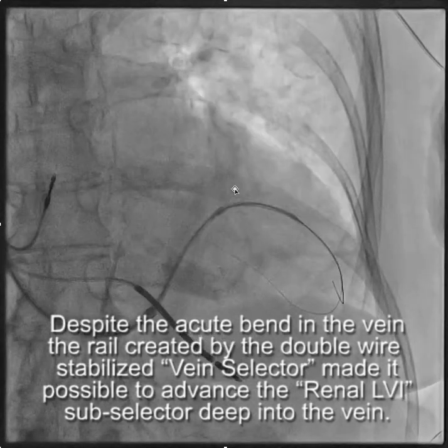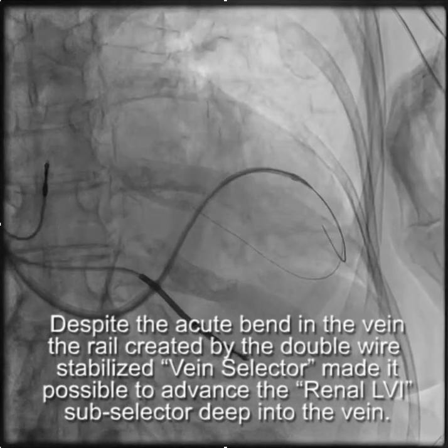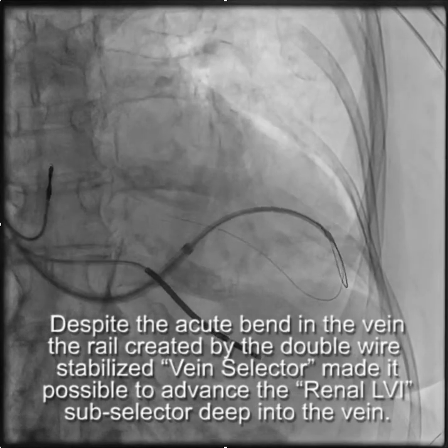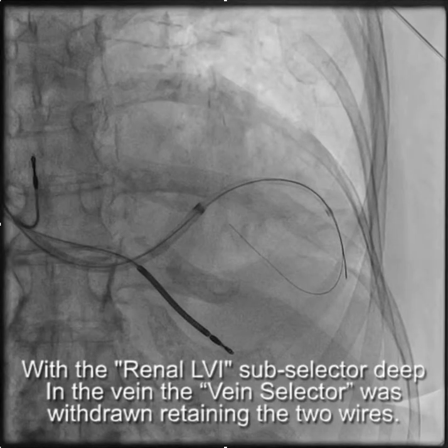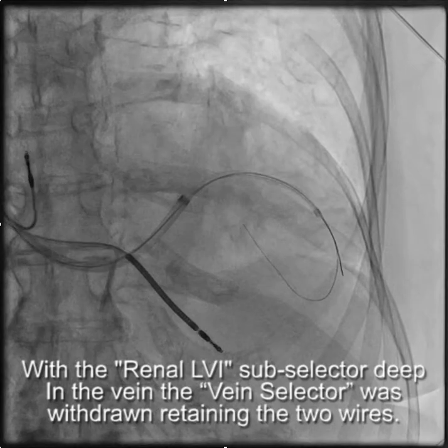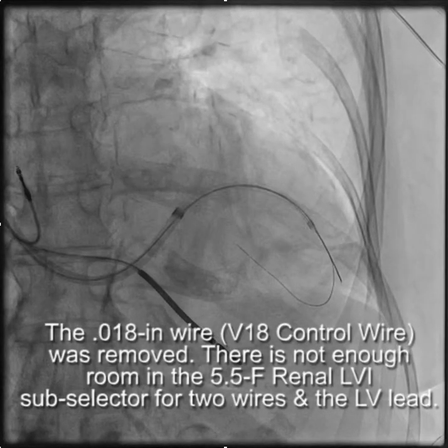You can see here, this is the renal LVI subselector being advanced deep into the target branch. And once the tip of the renal LVI is deep in the branch, we're pretty much good to go in terms of advancing a lead, because the lead's going to go at least as far as the tip of the renal LVI.